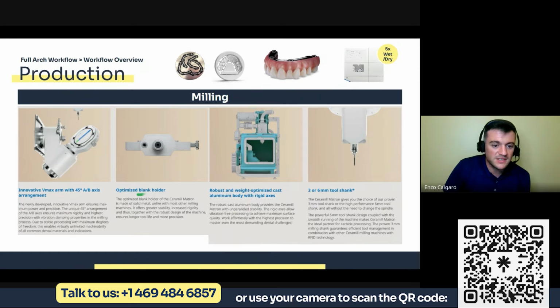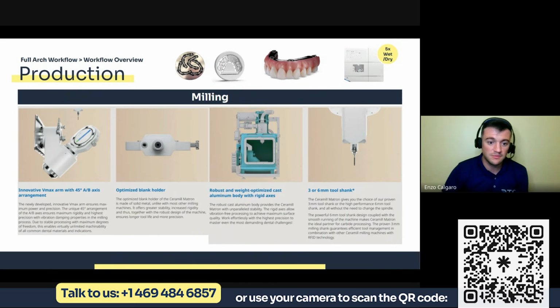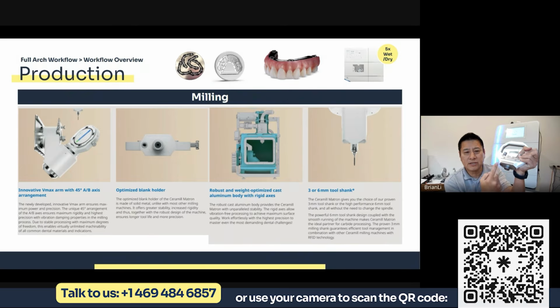Number two, you have optimized blank holder, and the metal holders, they have this, I think this is called the zero clamp system. Am I right, Brian? Yeah. So the metal holders, they have a bigger clamp here. And again, this is all to control vibration, to give more accuracy to the milling. Oh, there you go. Yeah, that's the base. That's the base for the clamping mechanism there.